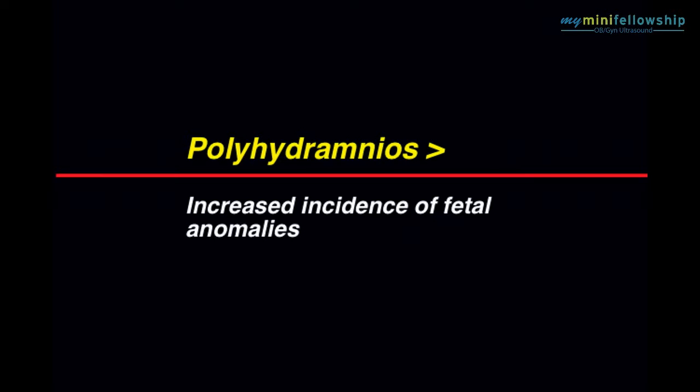So you see a case of polyhydramnios, you examine very carefully looking for fetal anomalies, and then you think to yourself, gosh, I sure wish I'd have paid a lot more attention during that lecture by Philly, because when the study is abnormal, your level of confidence is much higher than when the study is normal. You may not think of yourself as capable of excluding fetal anomalies, but I can assure you, you're more capable than you think.